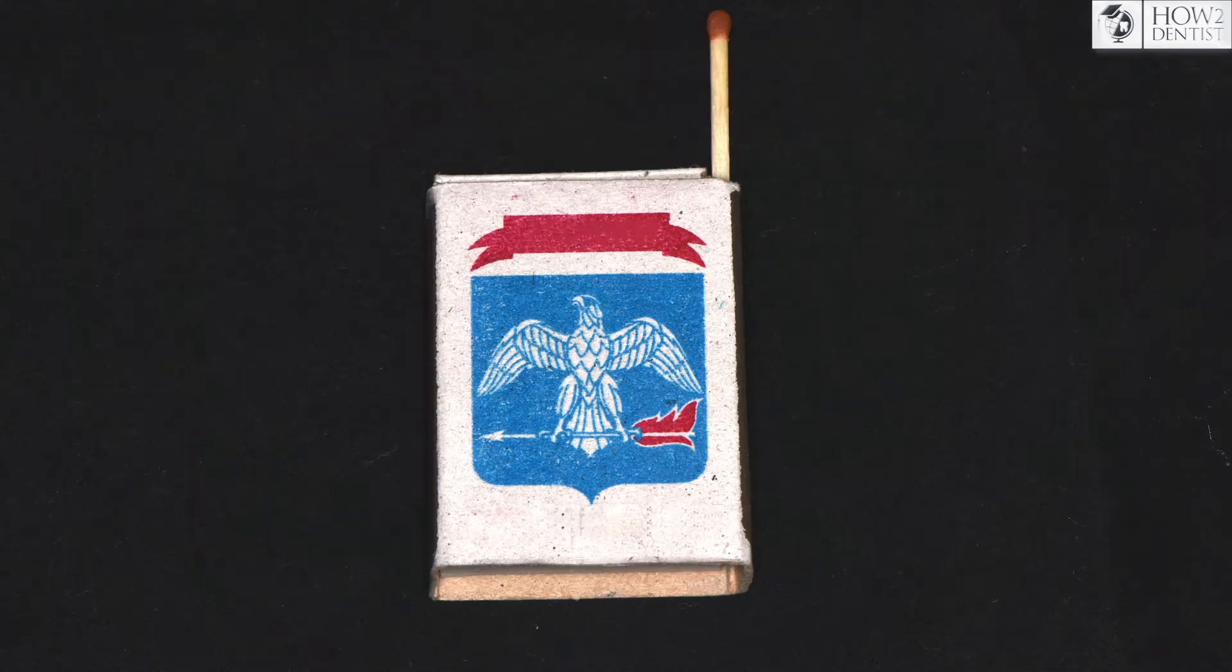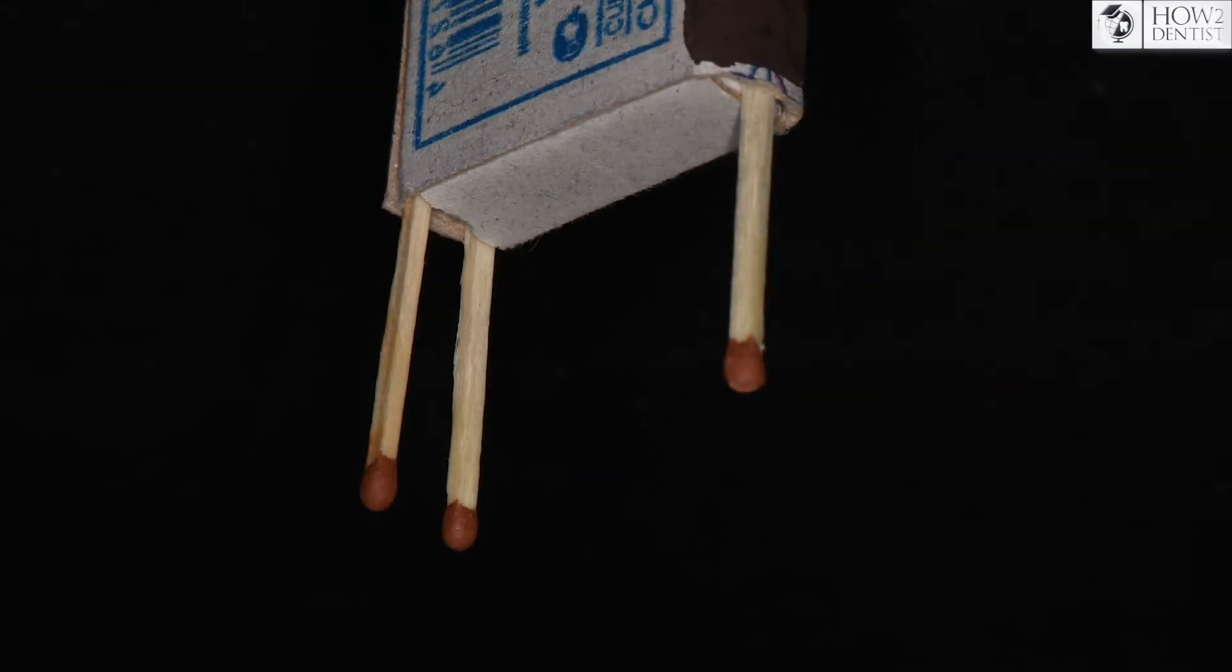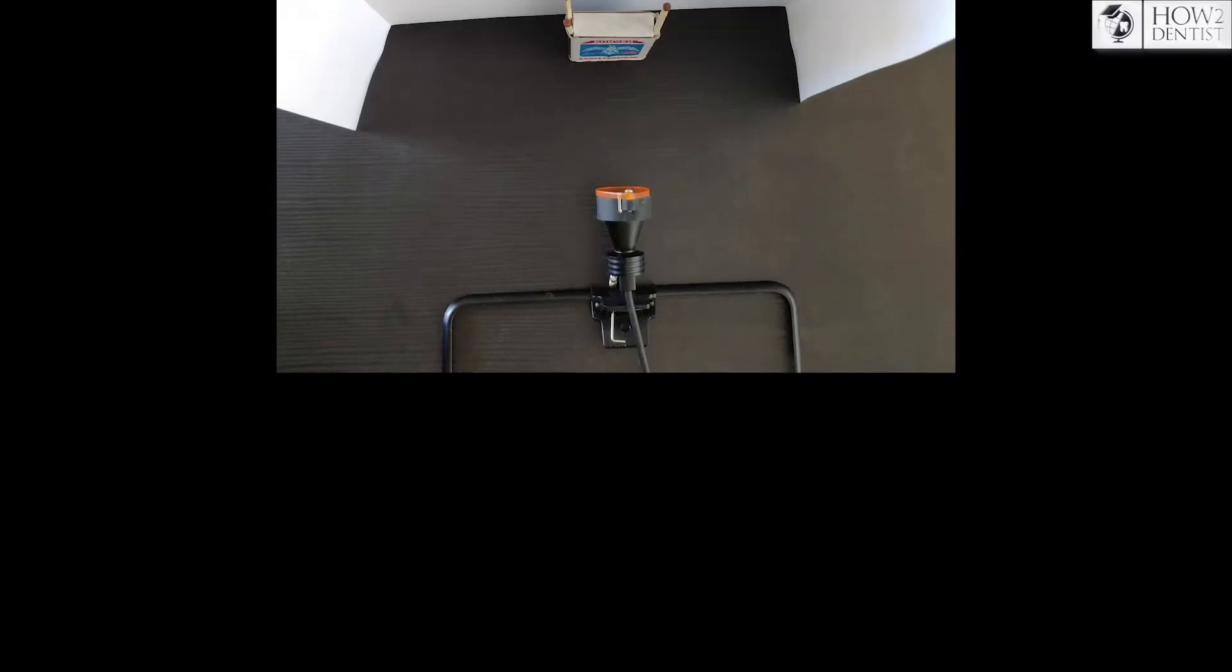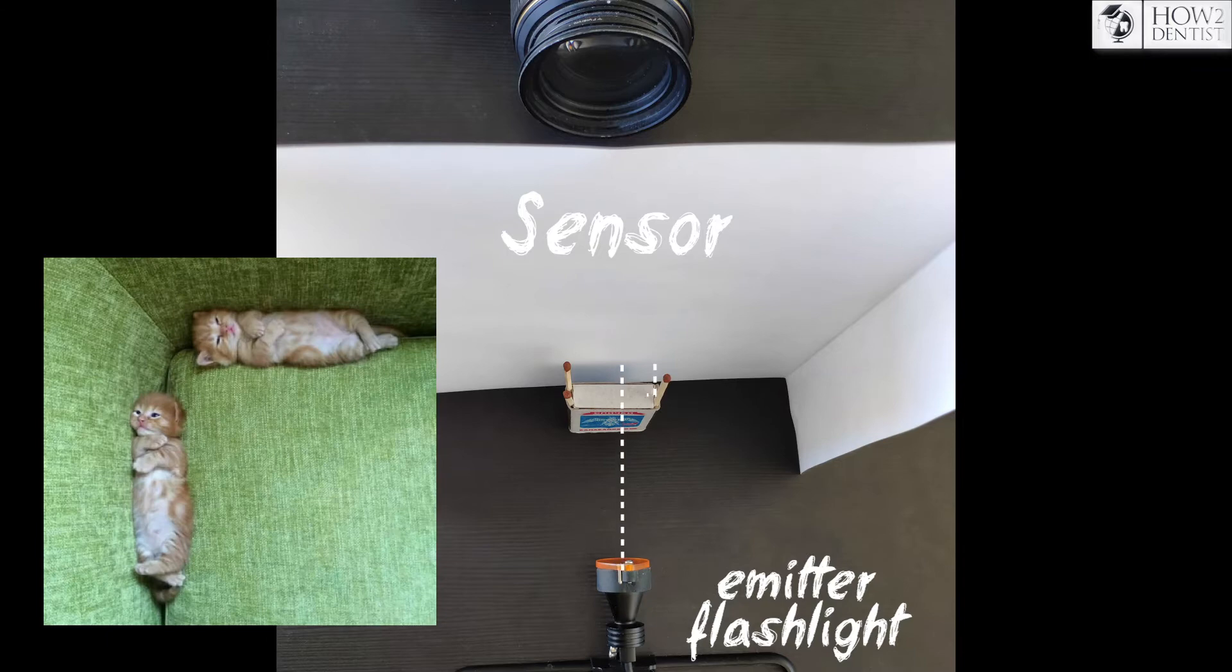Now we place the matches in the box as if they were the roots of the lower molar: the mesial, buccal and lingual, and distal. Then we place the sensor and flashlight. As can be seen from the picture, they should be perpendicular. Turn on the flashlight.